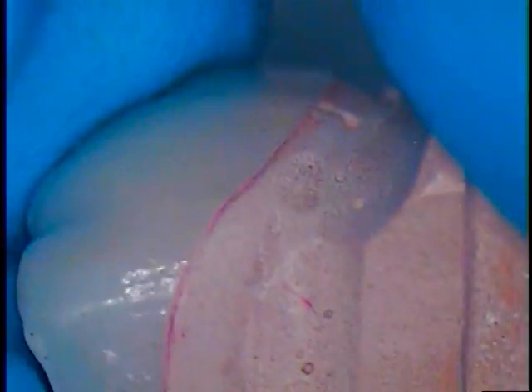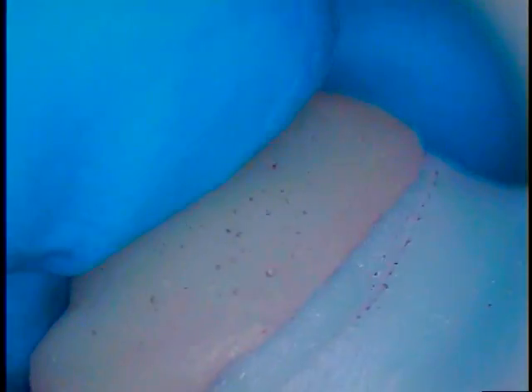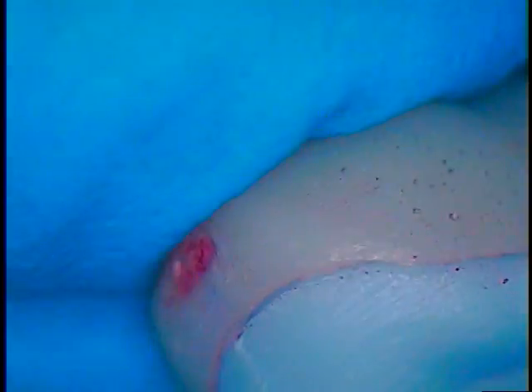And now we'll take that apart, and let's put the permanent again. We're looking at that. Flawless. Now, how about the contact area? Oh, even before that, let's put our handmade crown on the computer-generated die, and let's see what happens.